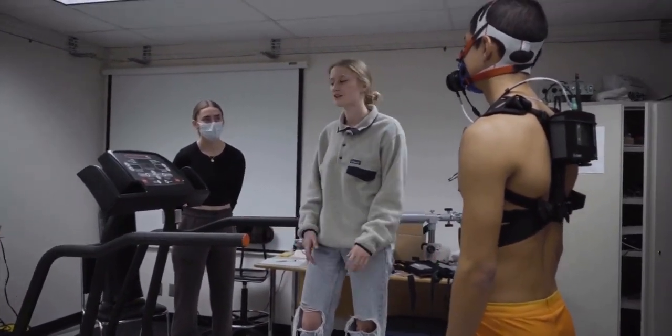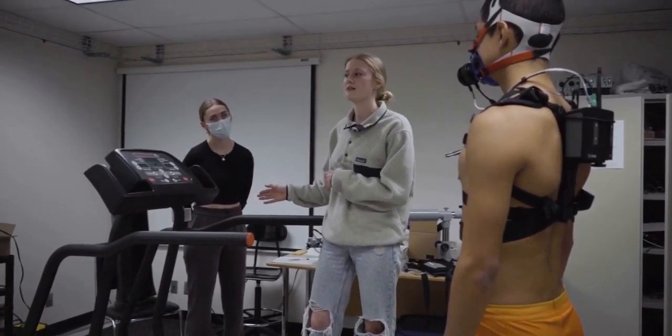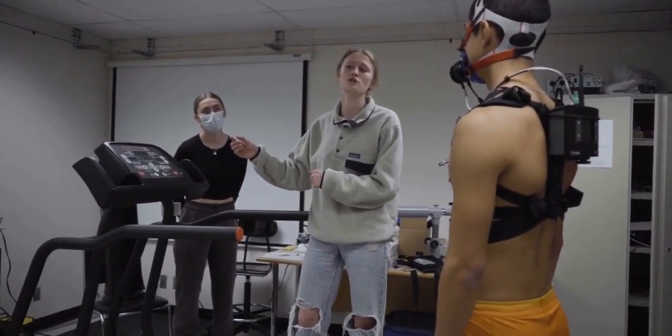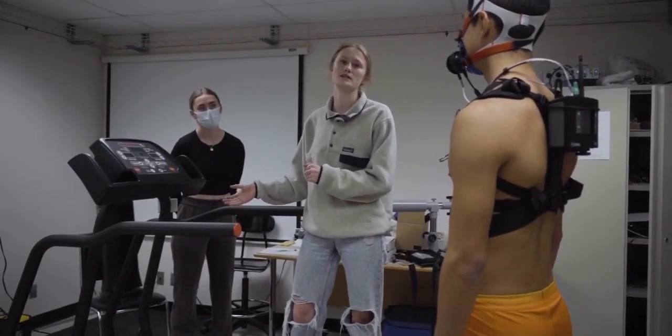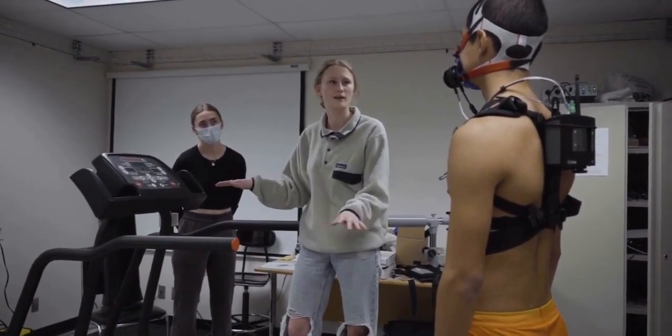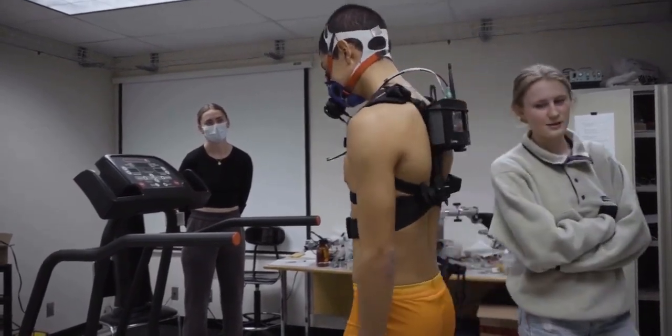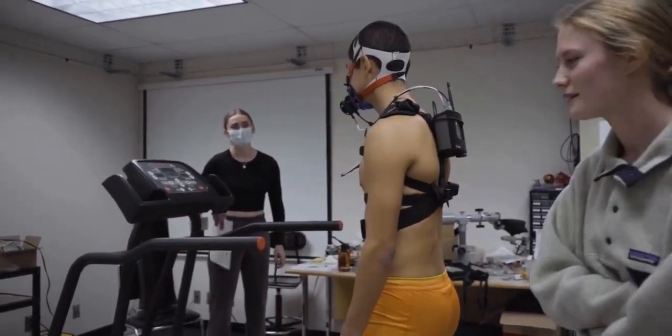It's not the end of the world — just stabilize yourself and keep going. If you want to end your test before the next stage, when we say speed or incline and we're about to switch, just let us know that this is it. We're not gonna tell you when you end. It's up to you when you think you're done, but you'll know.